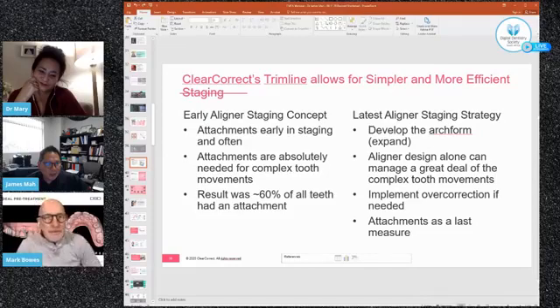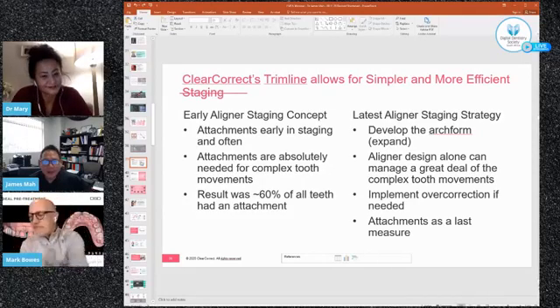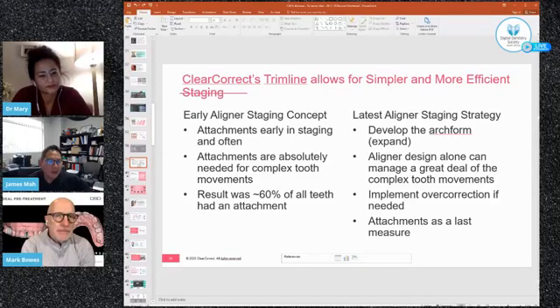Yeah, and the last thing I would add is we are looking at this in quite some depth. With patients that brux, we do a nighttime myo monitoring. We have take-home monitors, which are surface electrodes, and we get some baseline data on it, and we're following those as well. And of course, maybe it's controversial in South Africa, but we are injecting botulinum toxin in their masseters. Not controversial? It is or isn't? No, it isn't. Oh, okay. All right. So that's one of the things that we look at, and then we do post-op measurements as well to see what's happening with the bite force. But yeah, we'll follow up with that discussion.